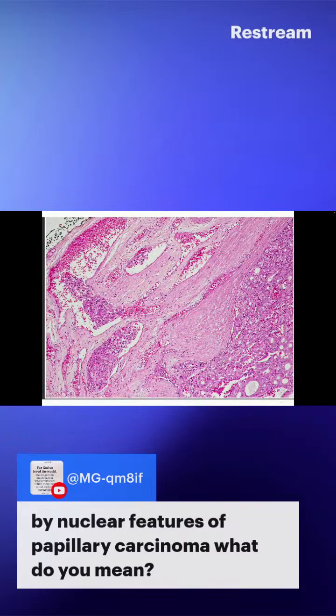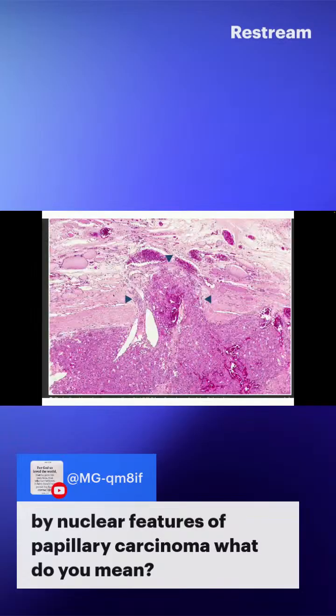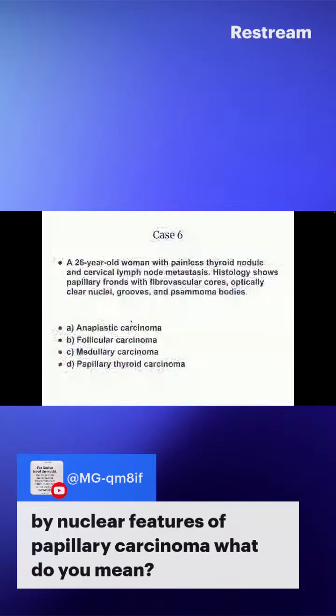And that's a picture of vascular invasion. What it means is this is obviously a vessel, there are blood cells in it. This is the tumor, and you can see here that these are follicular cells inside the blood vessel, which means that this is already follicular carcinoma. And that's also another example of capsular invasion. This is the capsule, and it's just budding outside.